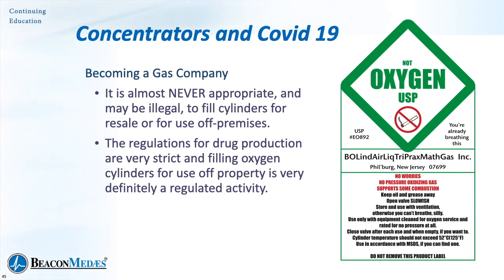It is almost never appropriate to do this. In most places, it is illegal to do this without the appropriate license. So the answer is no. If you're going to fill cylinders, they are for use on your premises. Ideally, they are for use in fixed locations, so you would fill the cylinder bank that you remember seeing from the earlier diagrams, but you wouldn't want to take those cylinders and distribute them around the hospital.